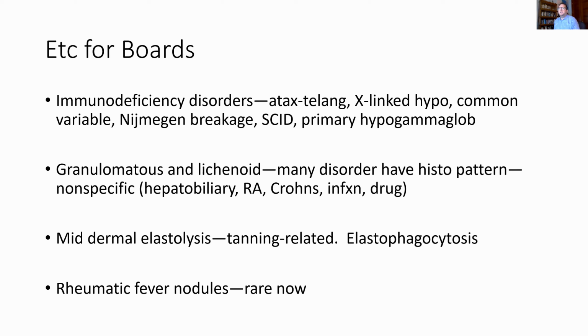So you can see it on the H&E, but an elastin stain can also be used. While it's active, lymphocytes will also be there, and then as it becomes inactive, you don't see the lymphocytes anymore. But this is very good. It's mid-dermal. It really does sit right there where the elastic fibers are, in the superficial to mid-reticular dermis.